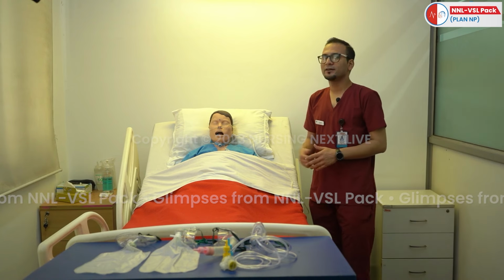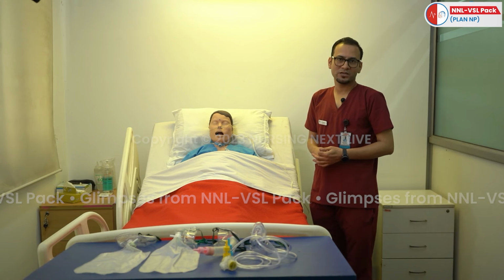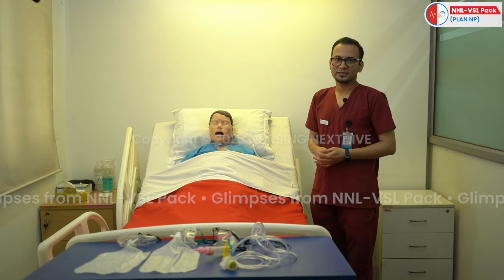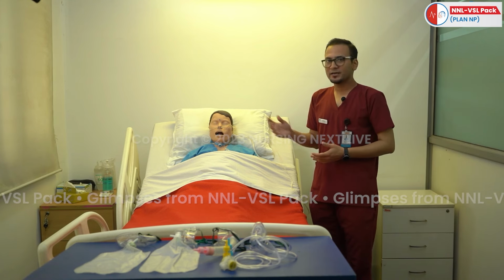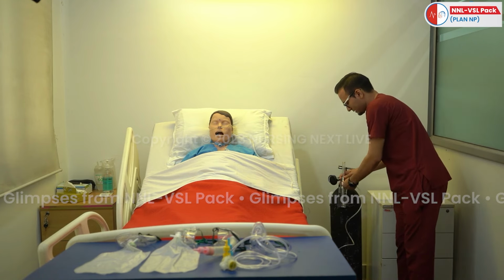And this device comes under the low flow oxygen devices. And this device is widely indicated for the patient who is having a mild respiratory difficulty. And it is contraindicated for those patients who are not able to keep the mask in place, patients who have facial injuries and patients who have a nasal blockage. This is all about the nasal cannula or nasal prong. So next we'll discuss the simple face mask.